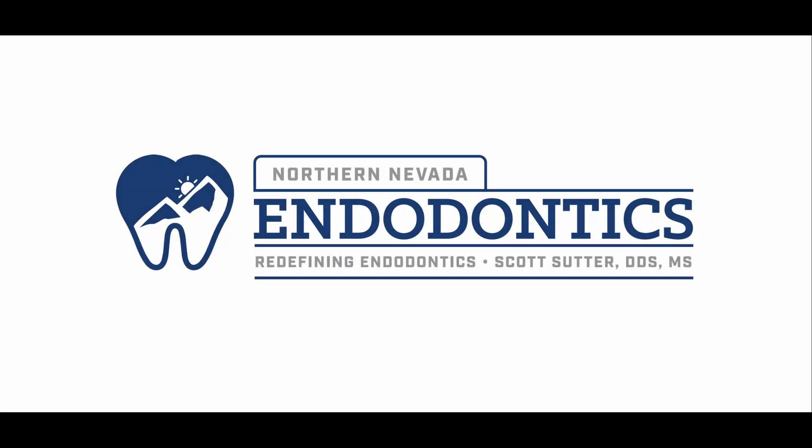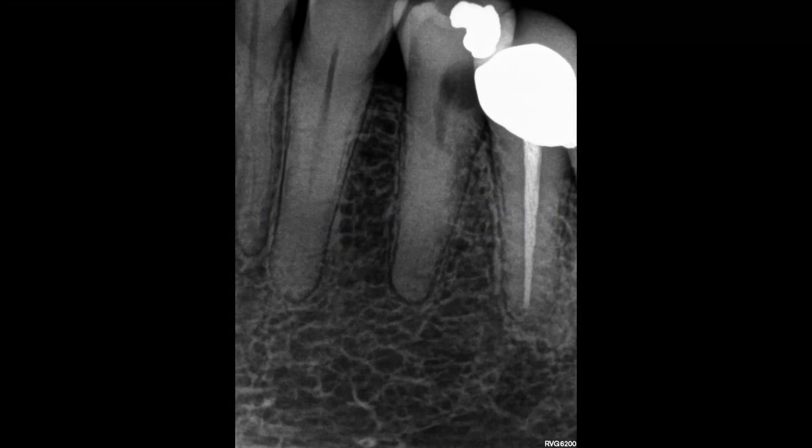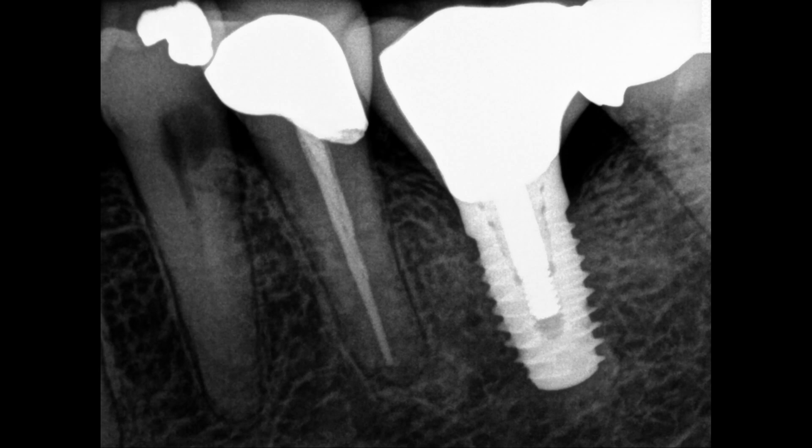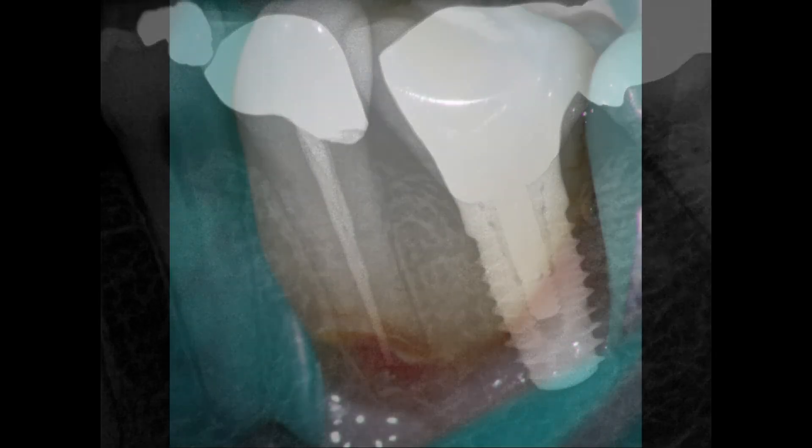Hello everyone and welcome back. As you can see from the thumbnail, the question here is whether or not this tooth needs a crown. So 70-year-old patient, lovely lady came in, really doesn't have that much restorative history — you can see a couple things here and there — but she said she's mostly been going for cleanings and has this deep Class 5 filling.